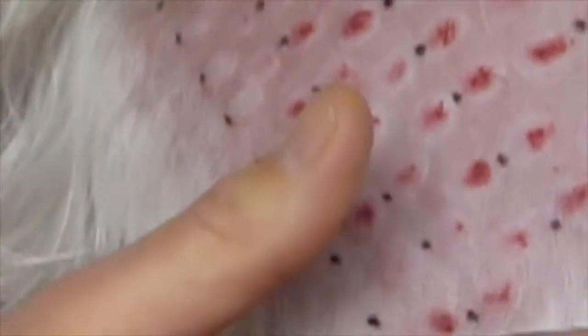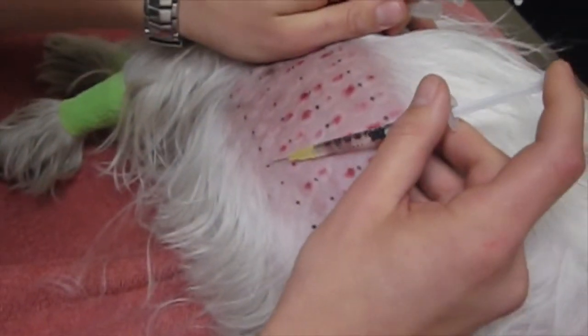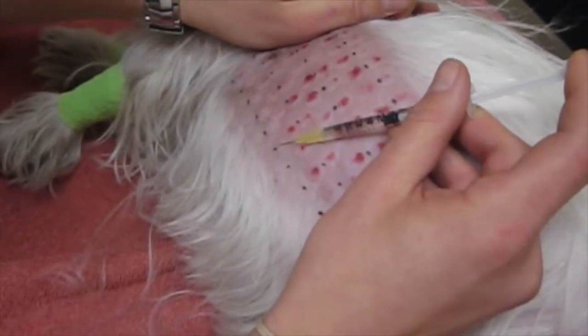You can see that she's still a little bit awake, and that's fine — we like her to be awake. We're almost done. After we're done with all of these, we'll wait about 10 to 15 minutes after each injection, and then we'll come read the skin test.